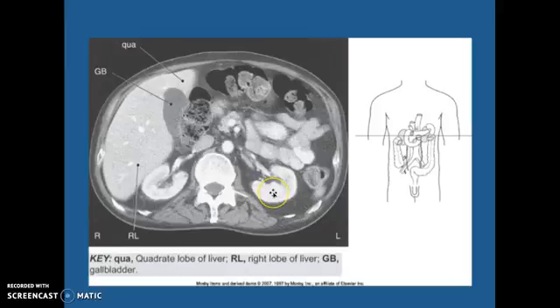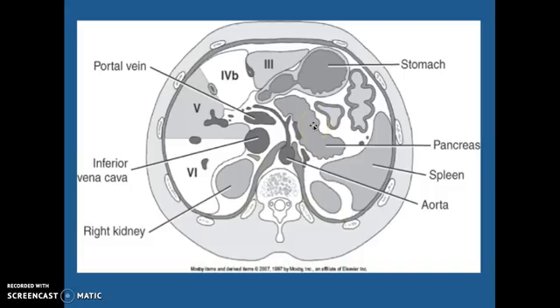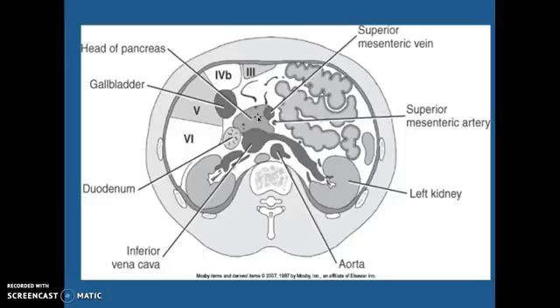This is arterial phase of contrast for CT, so the kidneys are nice and bright along with the aorta. I wanted to show you this one in the sense that here's your aorta, inferior vena cava, and your portal vein. So aorta, inferior vena cava, and gallbladder, and you have your portal vein that's going to be right in here.